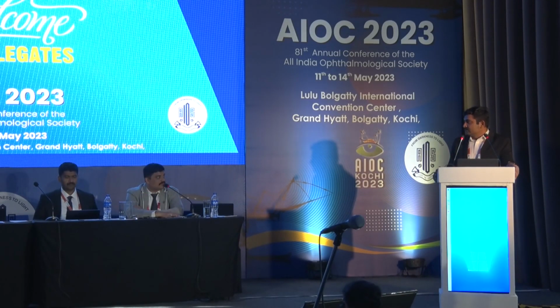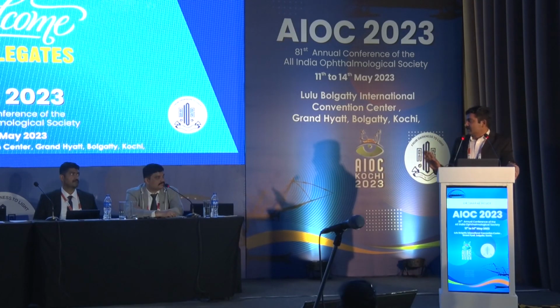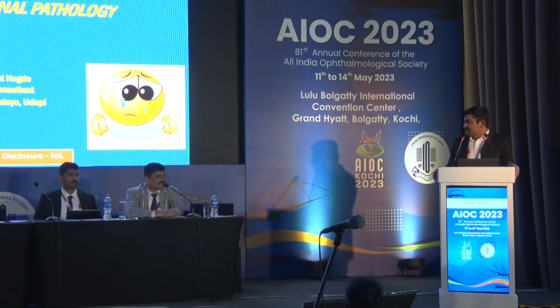Then how fast do you do the YAG capsulotomy whenever there is a capsular distension syndrome? Yeah, capsulotomy is the last resort. It could be better to go into the AC and try to aspirate as much as possible. The only disadvantage of YAG, as I told, is that if it is an infective pathology and you are suspecting it even a little bit, and it enters the PC, it may cause inflammation. That is the only concern. Otherwise, YAG is the simplest of the simple procedures. Yeah, thank you so much, Dr.